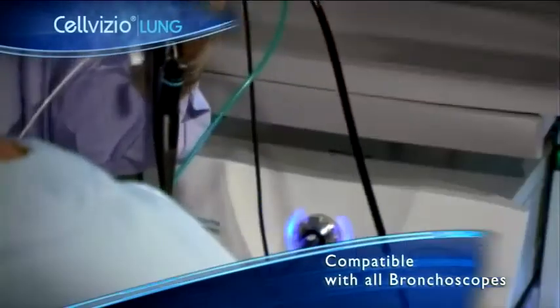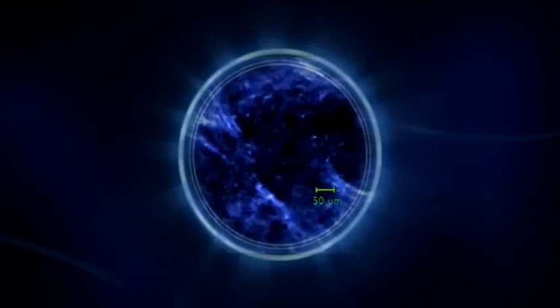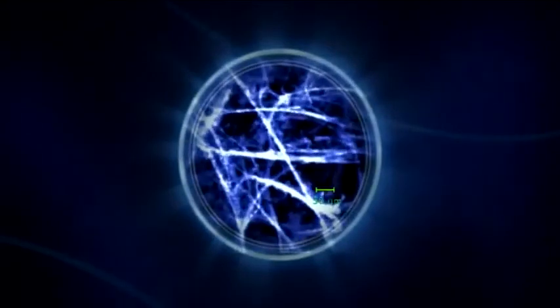The potential for current and future applications is immense. A whole new world in pulmonary imaging is unfolding.